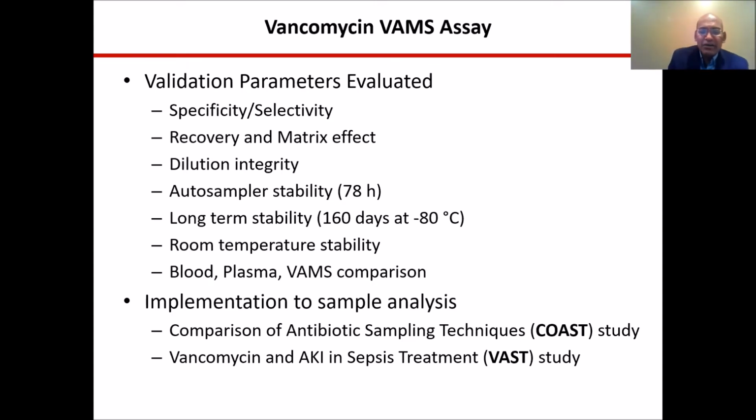And the second ongoing study also looks at vancomycin and acute kidney injury in sepsis treatment. This study also utilizes this assay for vancomycin pharmacokinetic analysis.